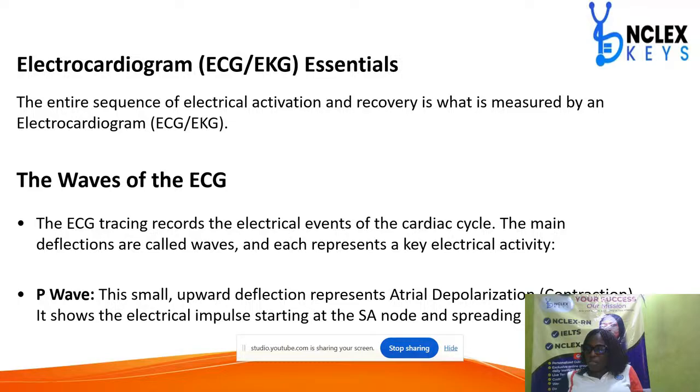So you divide one by 1,500, you divide the other one by 300. Let me see if you understand what I've said today. I'm sure we are tired, so let me leave us. We'll start from parameters to follow in order to read ECG tomorrow.